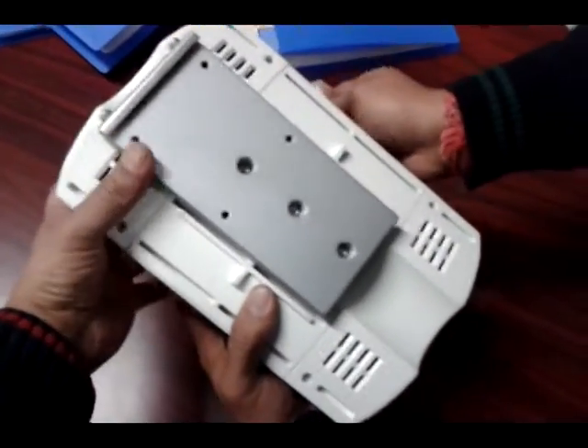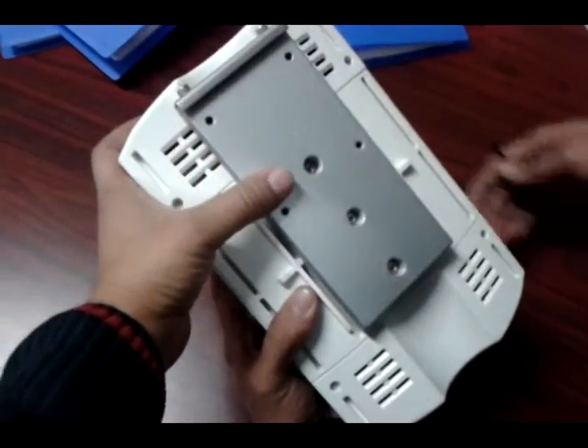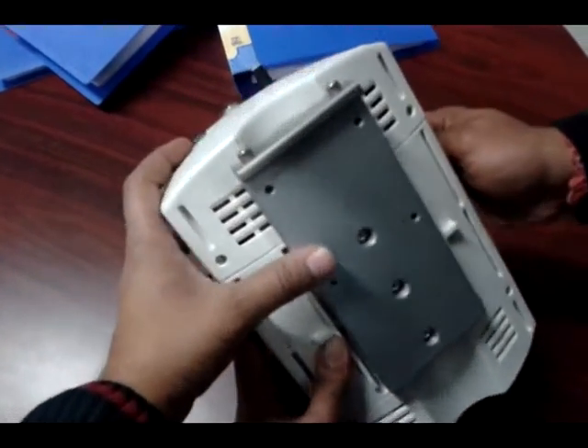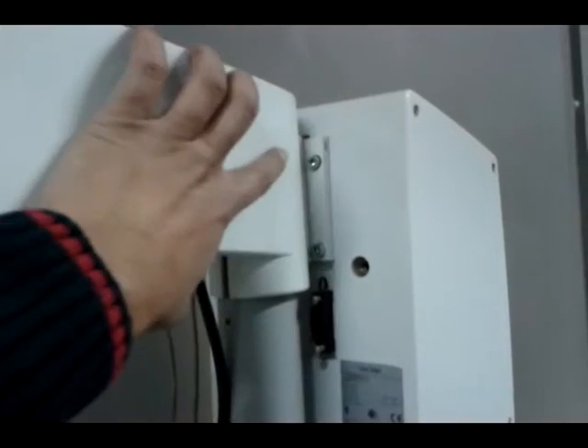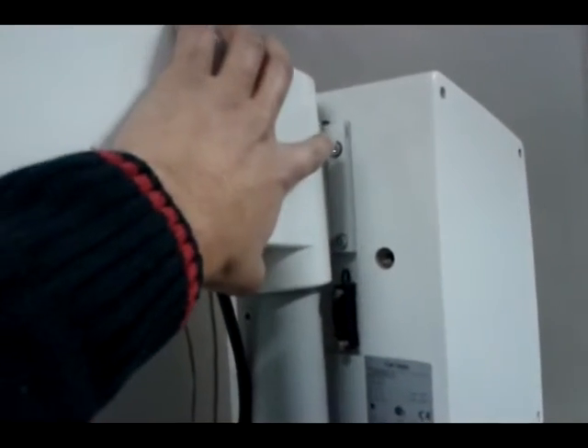Now this power supply is ready to install on the Zeiss microscope. Now unsecure these screws — one, a second screw, and two on the back side.